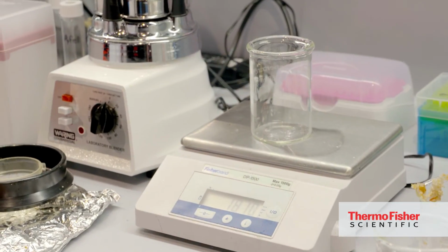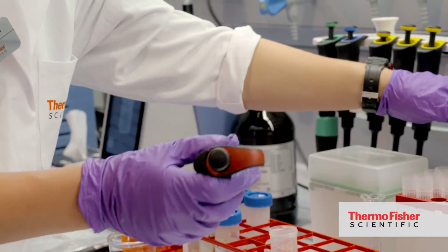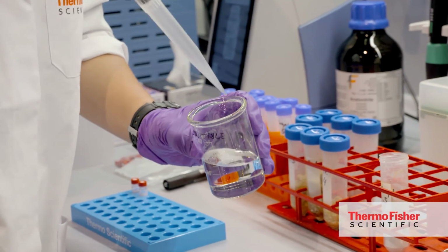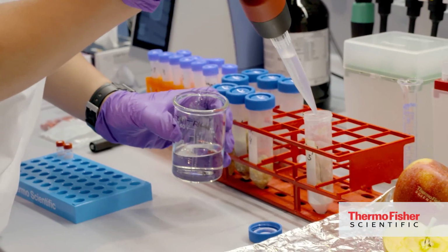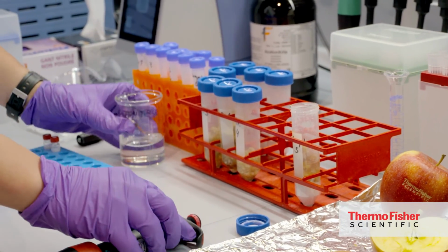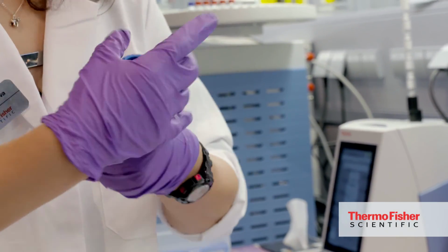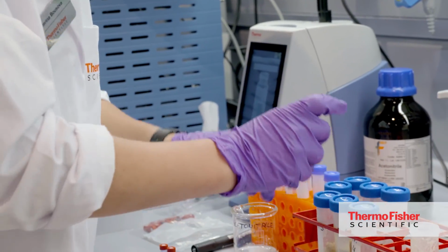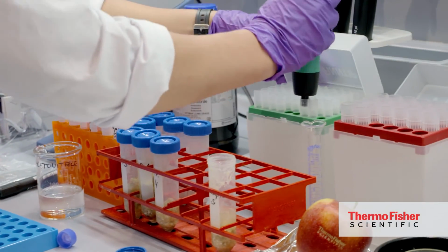So whenever the sample is weighed, then extraction solvent will be added to it. To 10 grams of sample, we add 10 milliliters of solvent. And the whole tube will be shaken. So normally the centrifuge tubes are centrifuged so that the solid and the liquid parts can be separated.